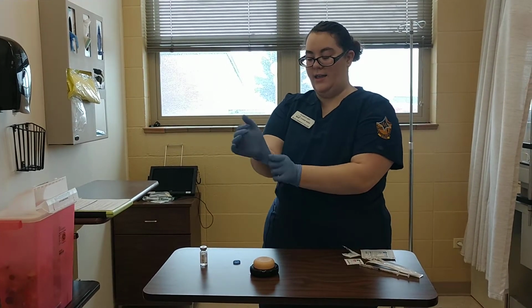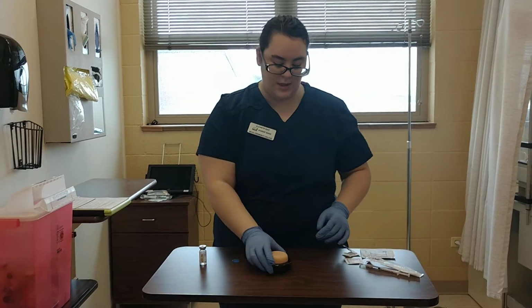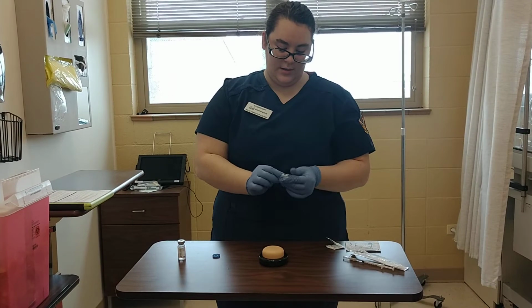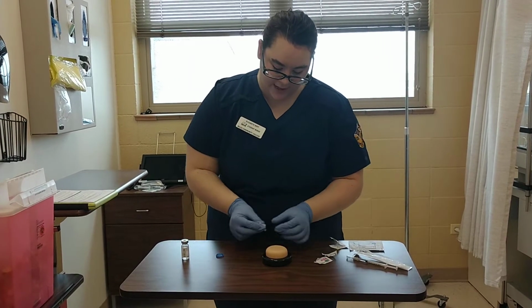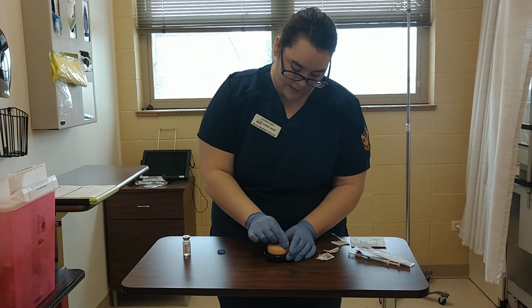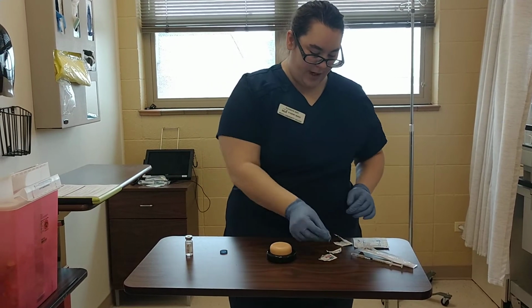After identifying the site and positioning my patient, I'm going to clean the site with an alcohol swab, starting from the center and working out. And I'm going to let that dry.